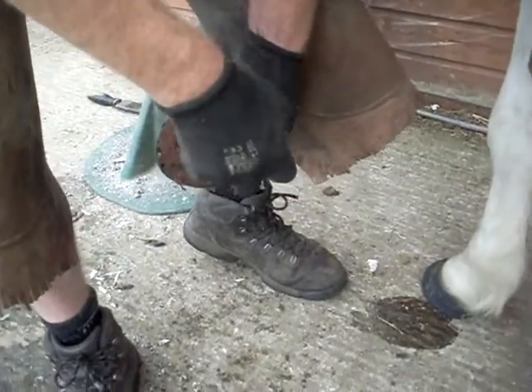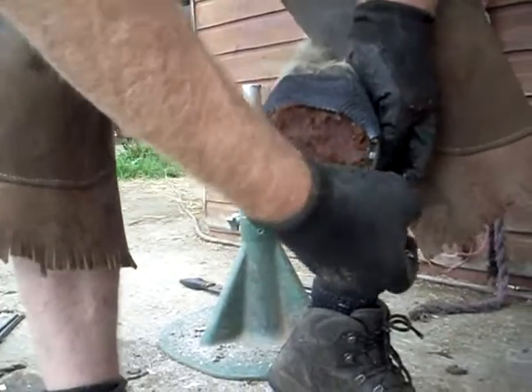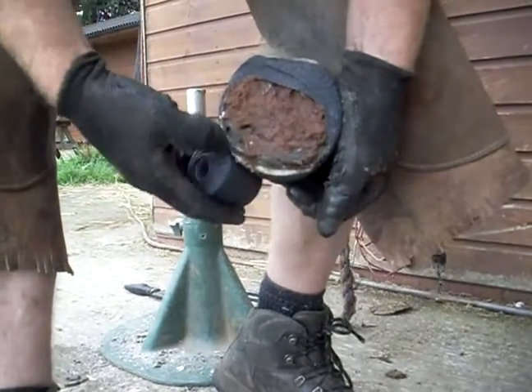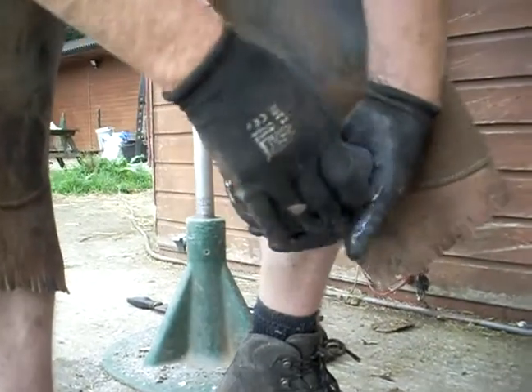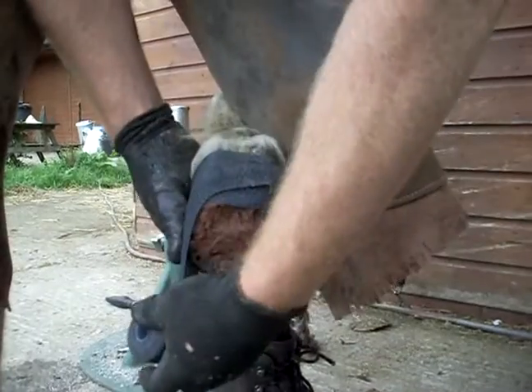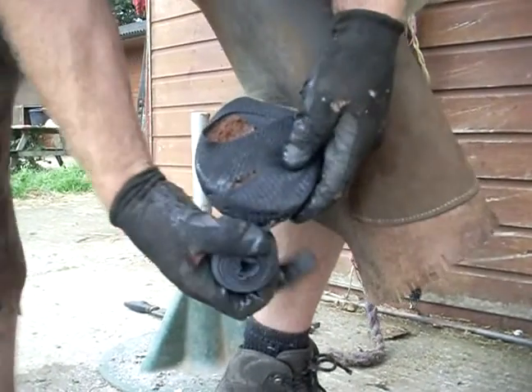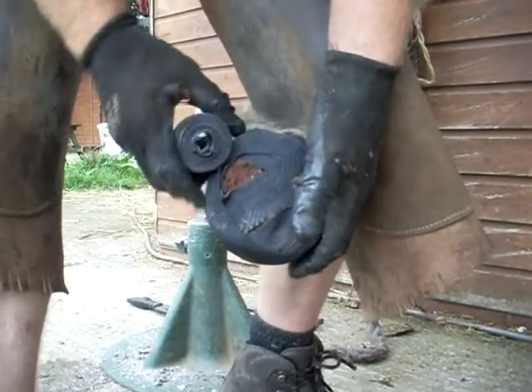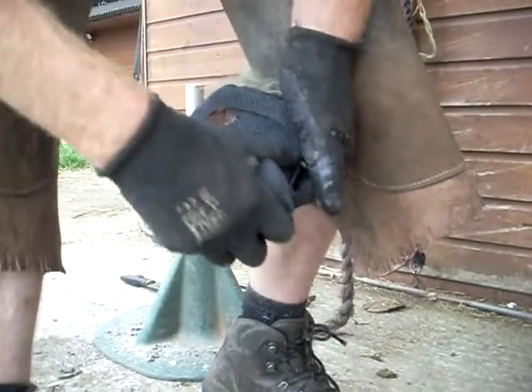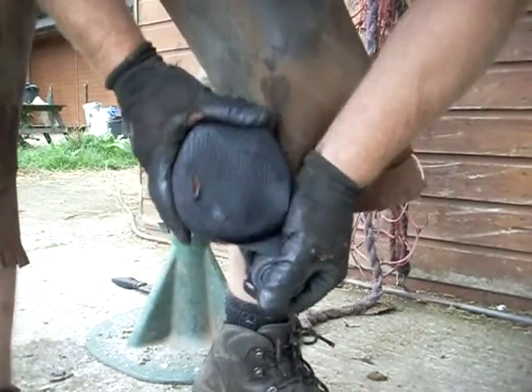As I've demonstrated before, it's always easier if you start from the back heel and just come round and round, being careful not to go up over the hairline or up over the bulbs of the heels. Just putting a slight tension on it, making sure it adheres to itself and to the foot. We just crisscross because I want to build up a nice supportive sole area.